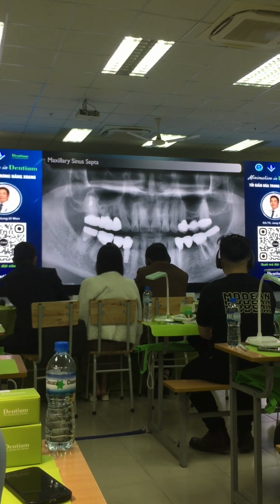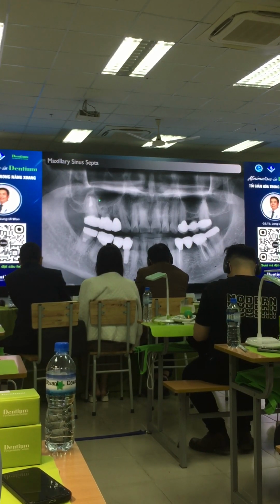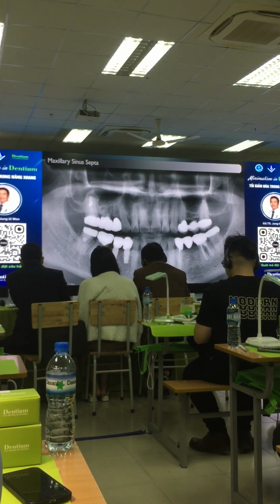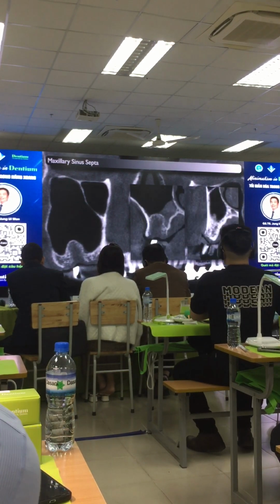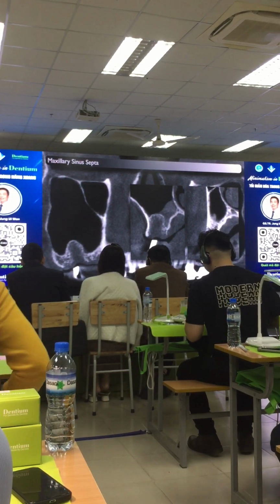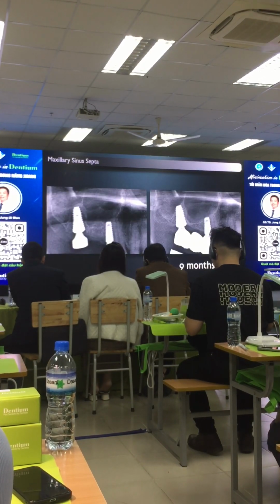In this patient, it was decided to extract the maxillary right molar because of endodontic failure. Even after extraction of the teeth, the bony protuberance was still remaining. This is how I avoided the invasive sinus surgery.